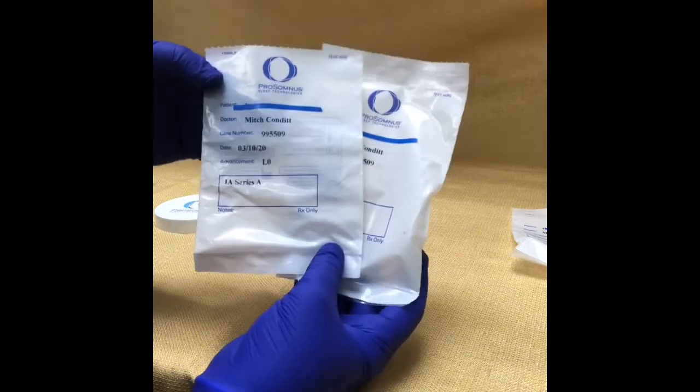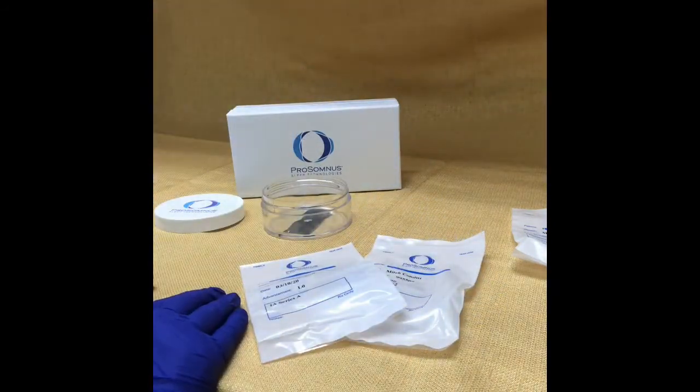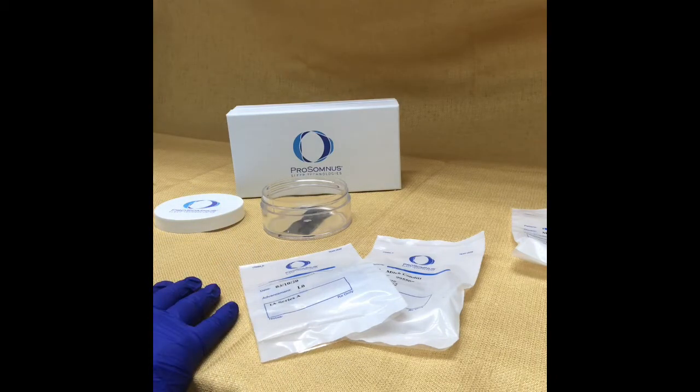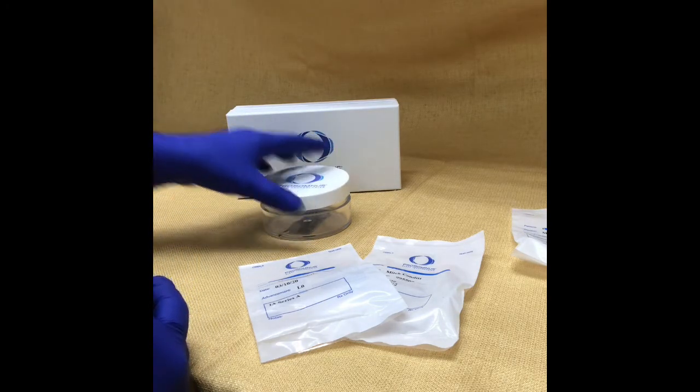Eventually you will run out of number combinations in the original set and box that you got. At that time, your sleep dentist — our office — would need to order your next advancement tray. Those do take sometimes two to three weeks to get in. So anytime the next number combination is not available, call our office right away so we can get that ordered. There's no additional charge for that additional tray — it's just part of the process.